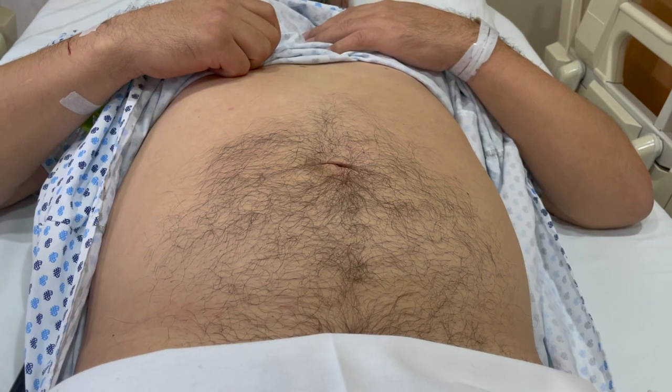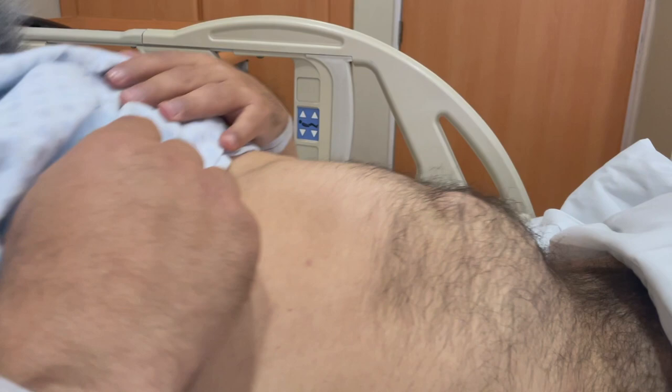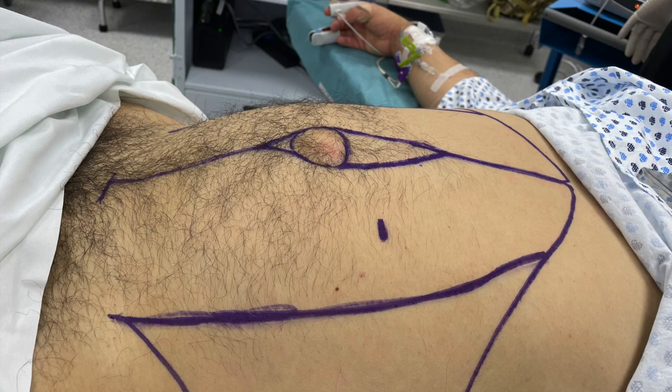Hello everyone. I wanted to share this recent case of an eTEP rives-stoppa in a gentleman with a primary symptomatic umbilical hernia and rectus muscle diastasis, which I thought was pretty straightforward to start out your practice for those who are interested. During this case, I'm going to lay out some of the key aspects of my surgical technique, and I hope it's going to encourage some of you to start out your practice.